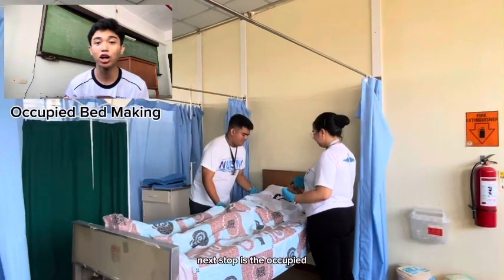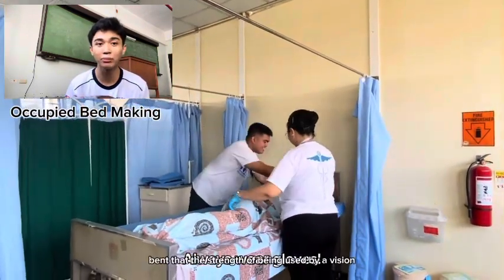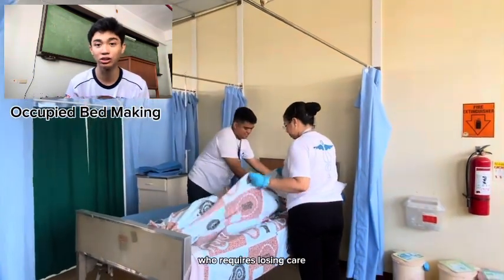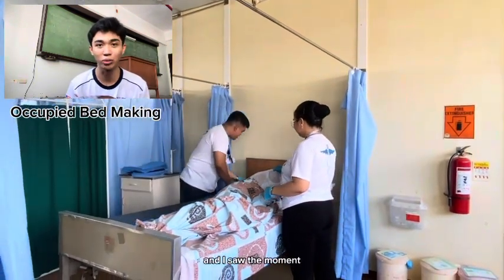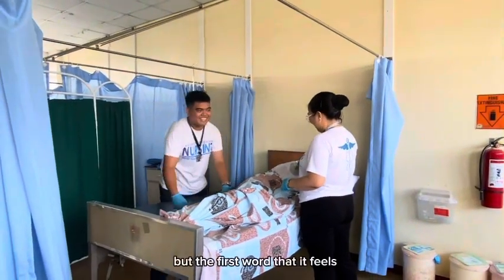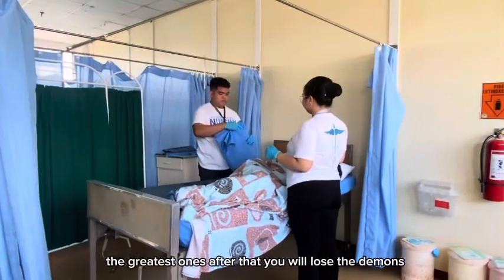Next up is the occupied bed. This refers to a hospital or healthcare facility bed that is currently being used by a patient who requires nursing care. This implies, of course, that the bed is not available for any other patient as of the moment. But of course, you will elevate rails on the patient-facing side to prevent falls.